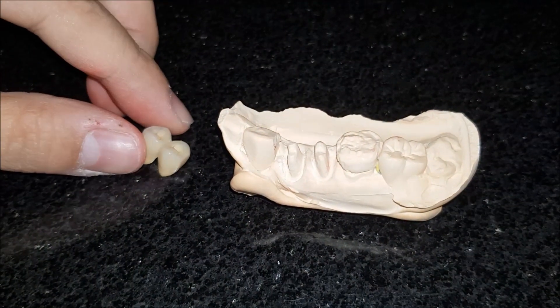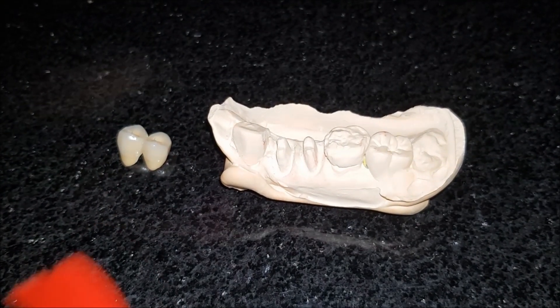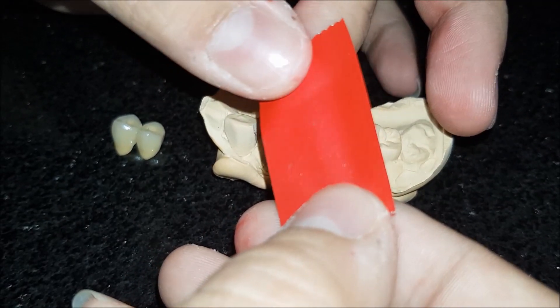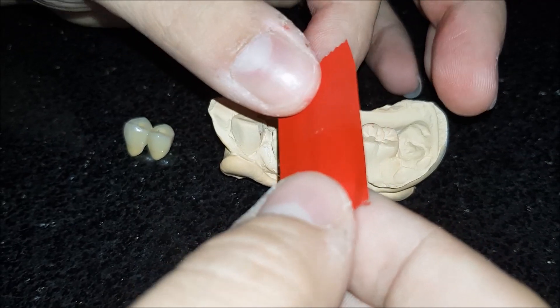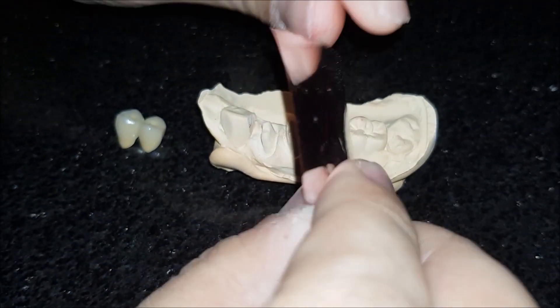This is how you check the proximal contacts between teeth. I do this with the help of articulating foil. What I have is Artifoil from Bausch, and it is 12 microns in thickness. It has color coating only on one side and the other side is metallic, so it gives me a static position.